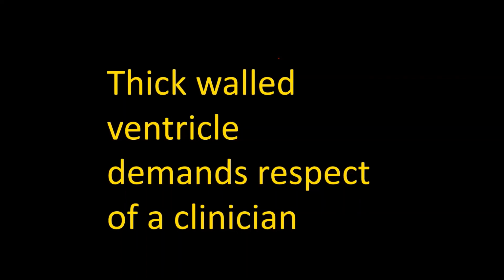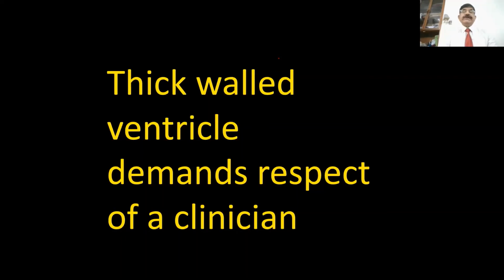Perfect, sir. So there is one more patient, the case history here. A female patient going for a non-cardiac surgery comes for a pre-operative cardiac clearance, as dehydrated, and echo: the septal thickness was 14 millimeter, gradient across LVOT was 28 millimeter of mercury. Should we label this as HCM? I think you should repeat the echo in better hemodynamic conditions.